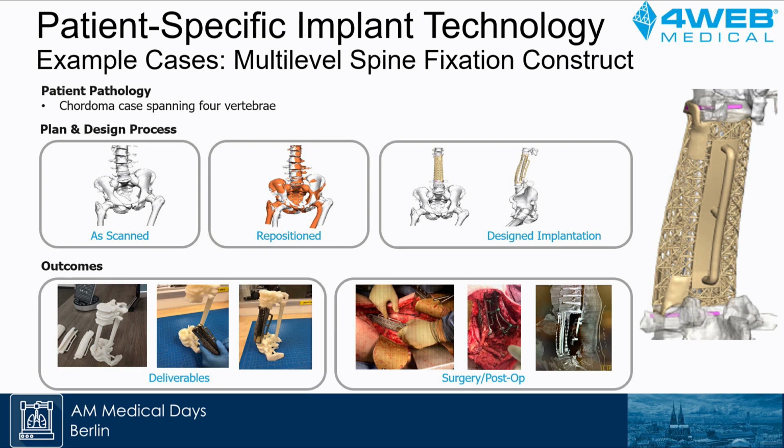What makes this device very cool is the engineer put a rod at the back of this device. As you can see, that solid rod is good for attachment to the screws and other fixation constructs.